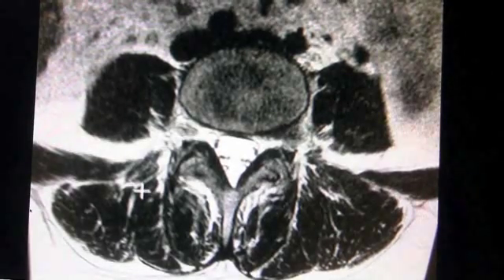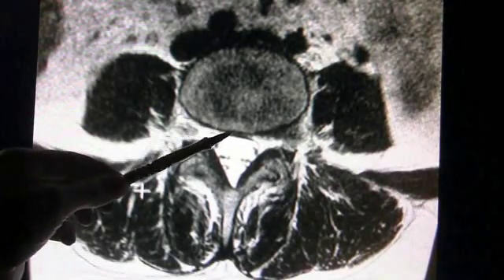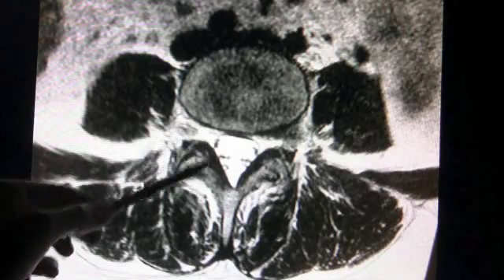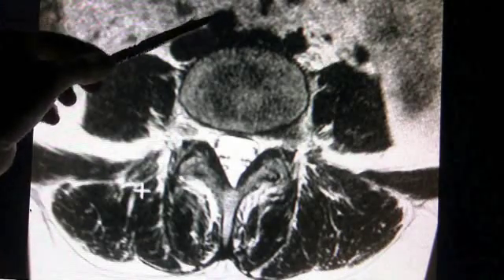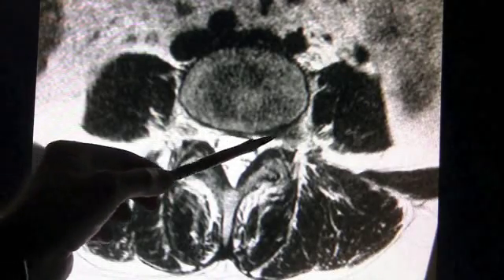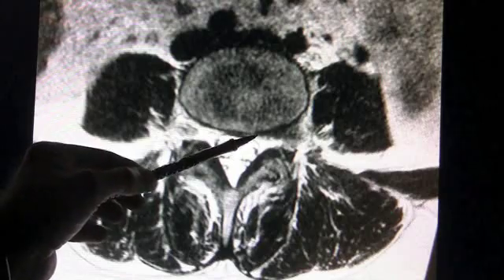This is an MRI scan of a patient with a herniated disc. The herniated disc is shown here — this is the right side, this is the back of the patient, the front of the patient, and this is the spinal sac in the very center. The left side here shows the herniated disc pressing on the nerve.